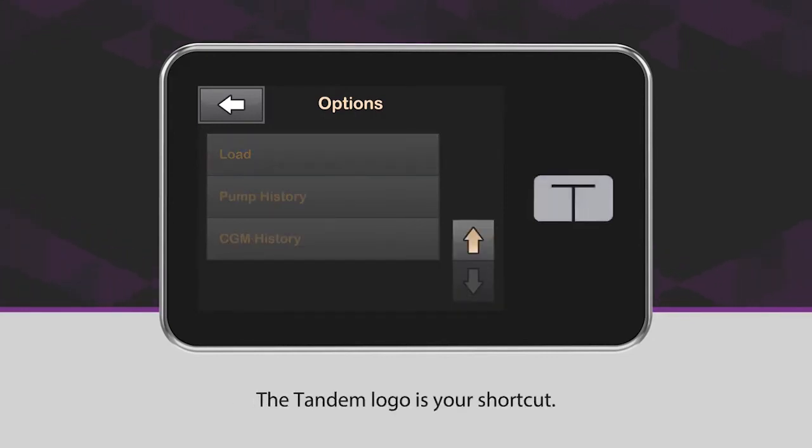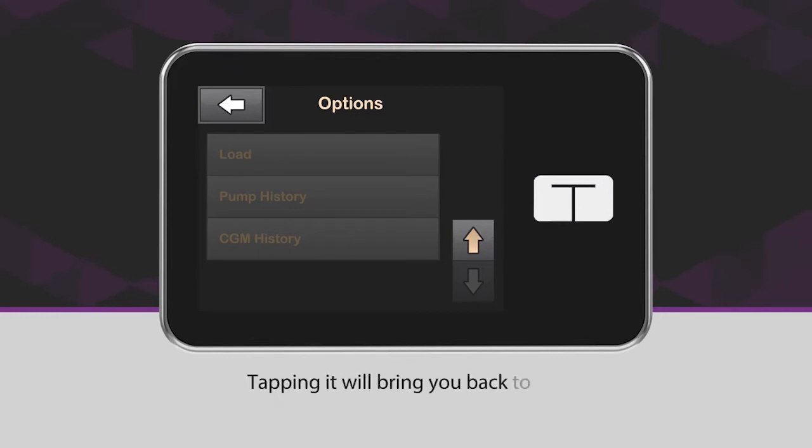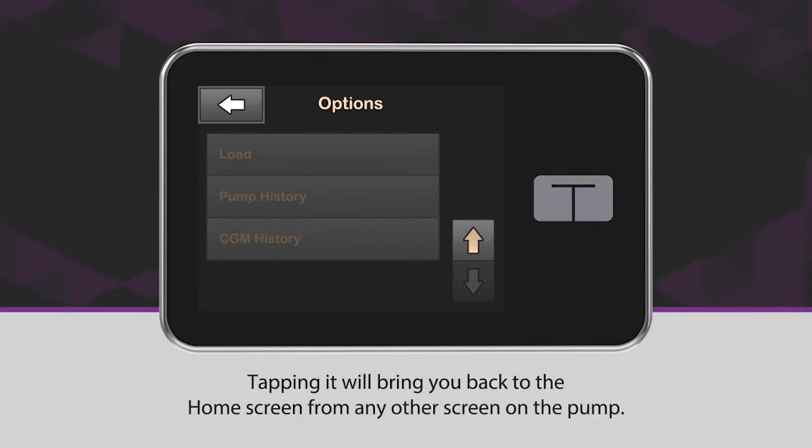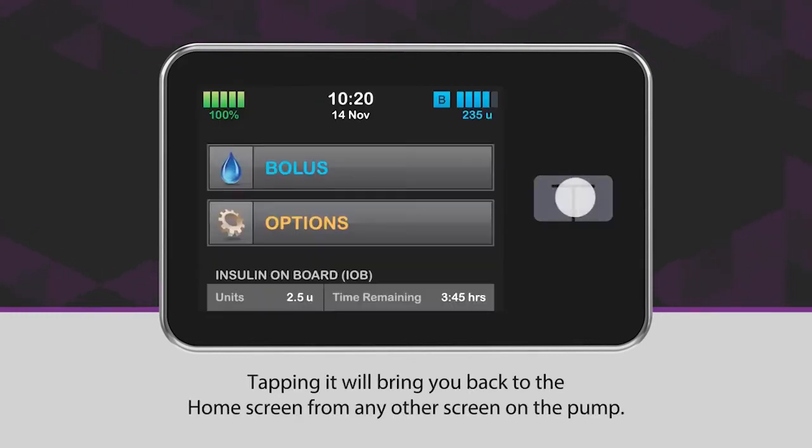The tandem logo is your shortcut. Tapping it will bring you back to the home screen from any other screen on the pump.